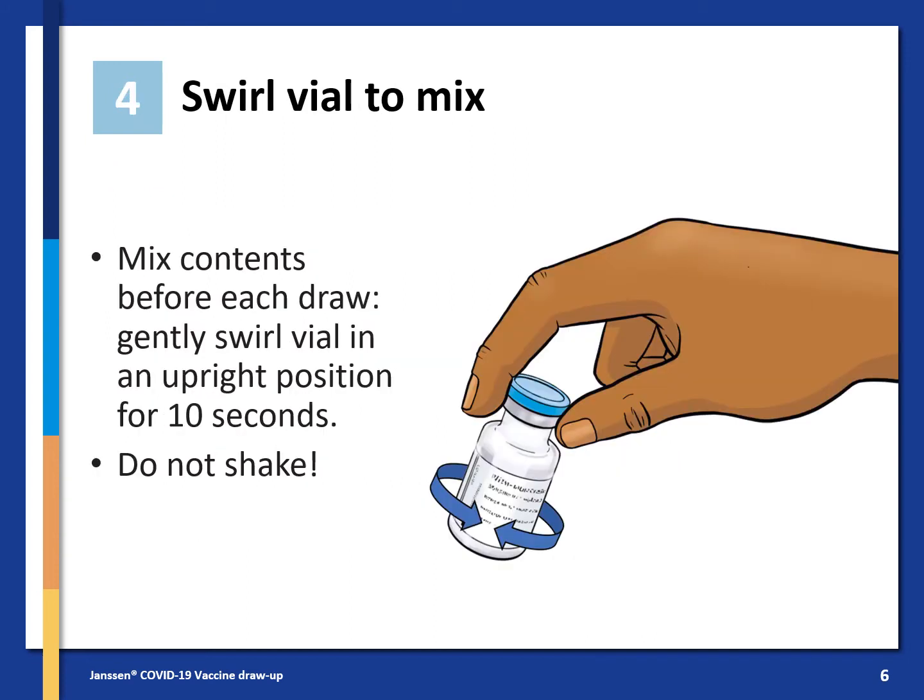Once you have checked and inspected the vaccine, you need to swirl the vial to mix the contents. Do this gently in an upright position for 10 seconds. Do not shake it.